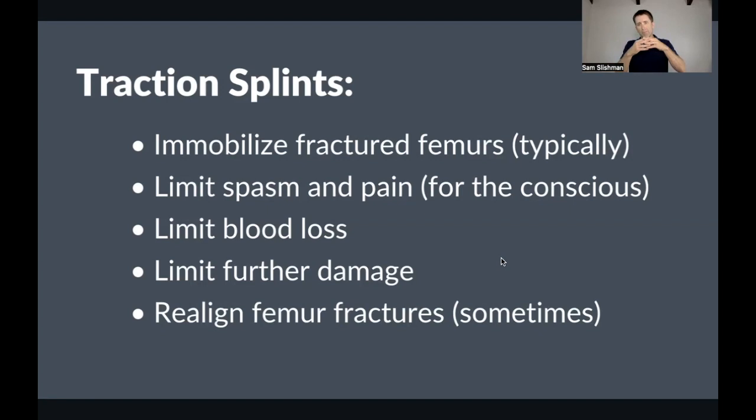So by pulling some traction, the way it's described, you're basically turning a sphere into a lower volume cylinder and hopefully leading to less bleeding into the thigh. You're also trying to limit further damage.